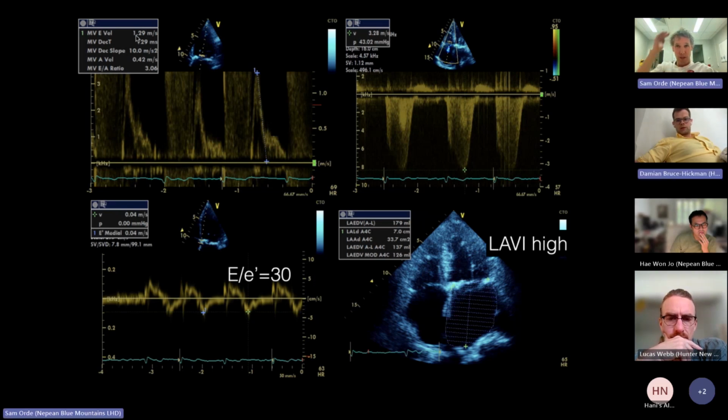So then, is there any form of definition as to what variability is with the E-wave inflows? Just not massive, that's all. Just whether it looks horrible or not. Yeah, you got it. Okay.